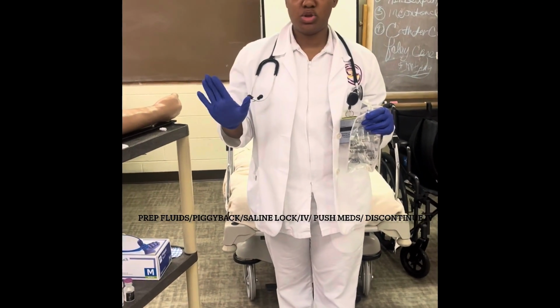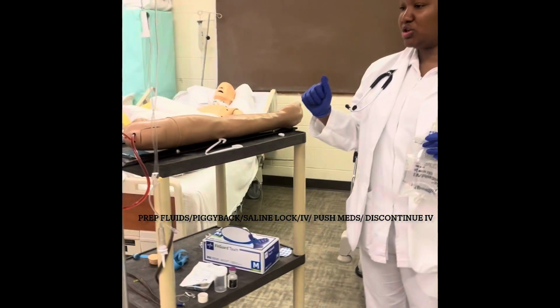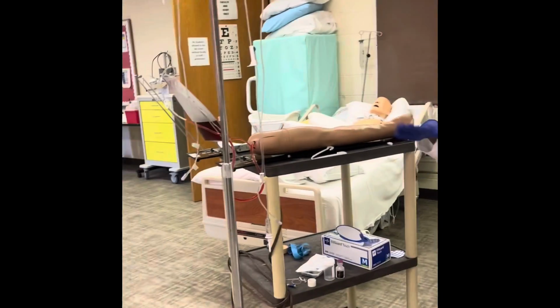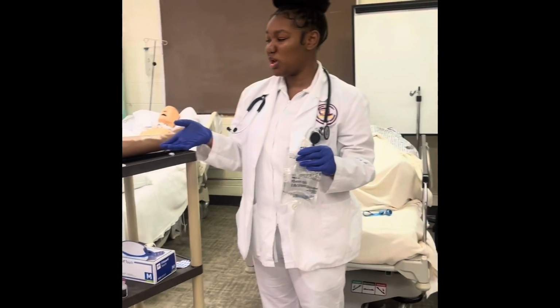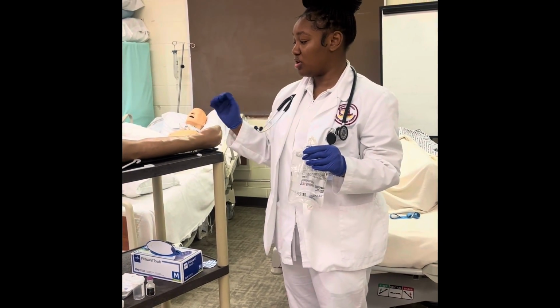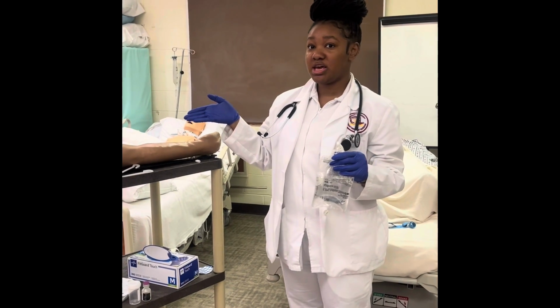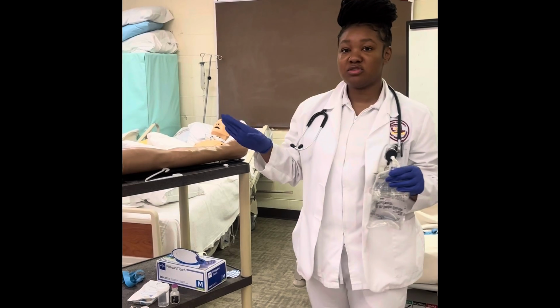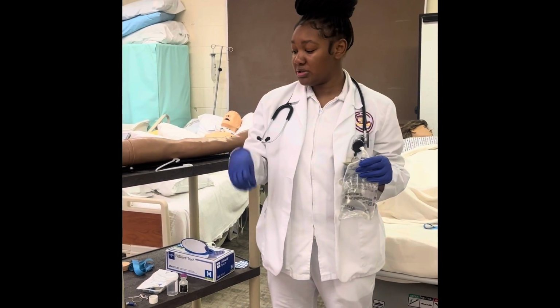Okay, hi. Right now I'm gonna be doing my skills. I'm going to be starting IV fluids. I'm gonna be starting a secondary fluid or medication. I'm going to be starting an IV, giving IV push medications, doing a saline lock, and then discontinuing my IV in this video. So first I'm gonna start by preparing my IV fluids.